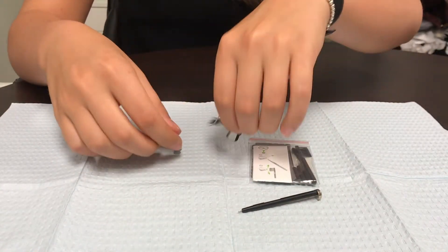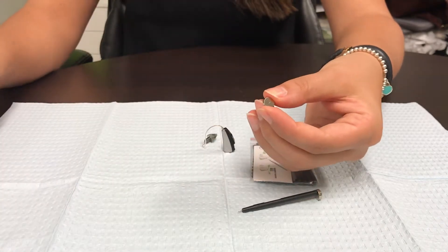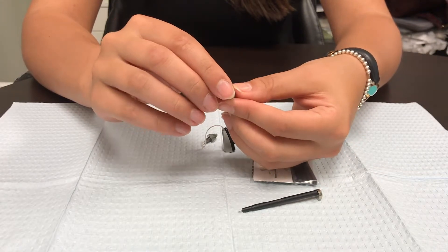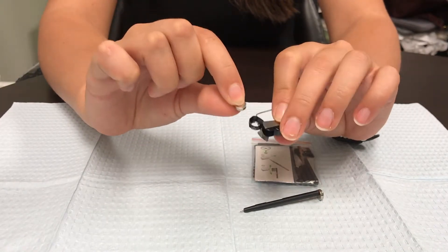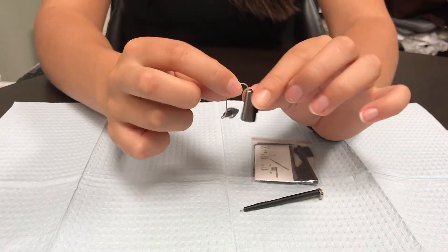The next step is to change your battery. You want to remove the sticker — these batteries are air activated, so you do want to let them sit for about a minute before you put them in. Then, when you are putting them in, you want to make sure that the flat side is facing upwards. Then close it and your hearing aid should be ready to go.